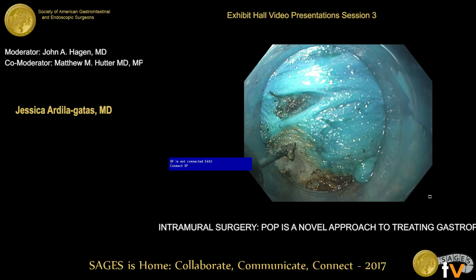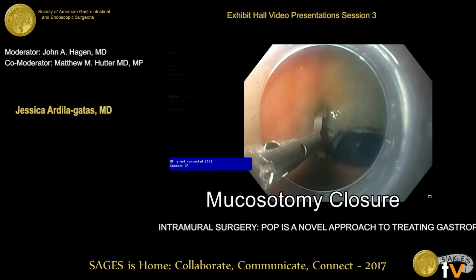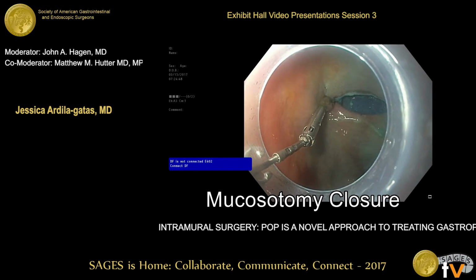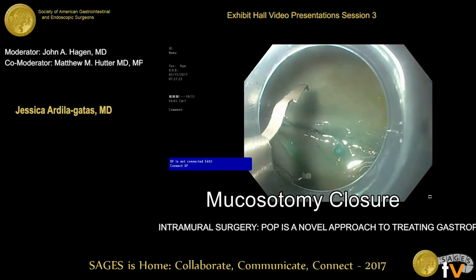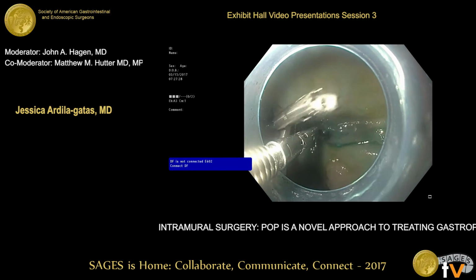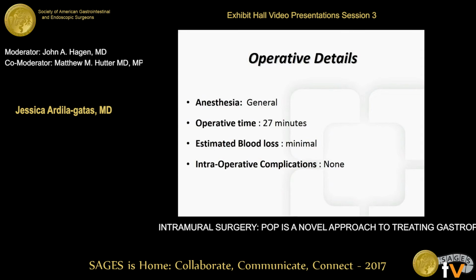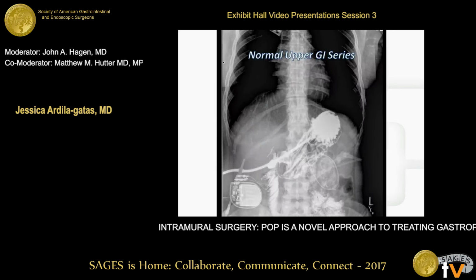Once the pyloromyotomy is completed, then we proceed with closing the mucosotomy with multiple endoscopic clips. The surgery was just under 30 minutes, and it was without any complications. The patient remained with nothing by mouth, and on postoperative day number 1, she underwent an upper GI that showed no leak or obstruction, and diet was advanced as tolerated.